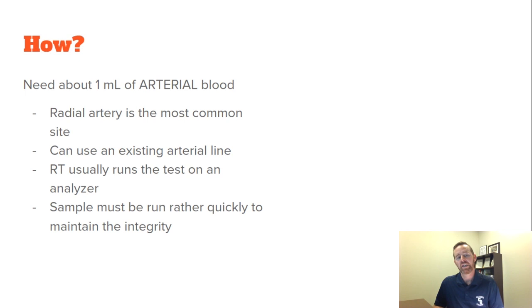All right, so nurses can do the test. RTs can actually draw the sample if necessary, or physicians can draw the sample, any of those people. But an RT usually is the one who runs the test. They take it to the analyzer and run it through, so you get your results.